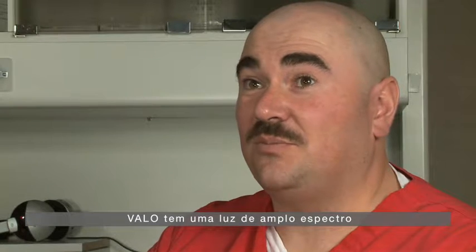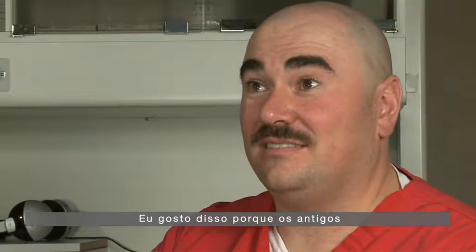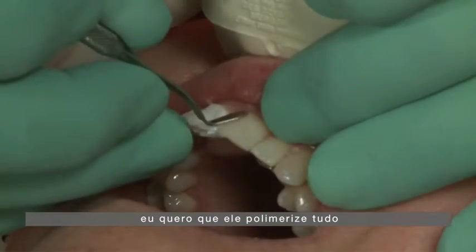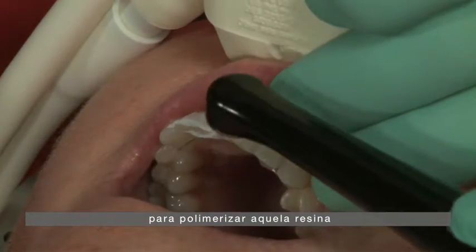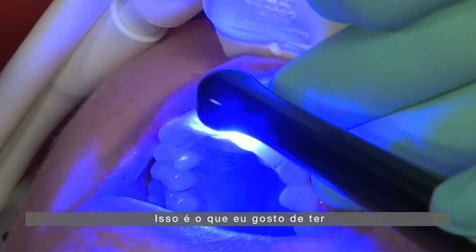The VALO is a broad-spectrum light. I like that fact. The old halogens were broad-spectrum. That's important to me because I want it to cure everything I point it at. I don't want to have to have a different light to cure this resin or another light to cure that resin. One light should do it all — that's what I'd like to have, and that's what VALO does.